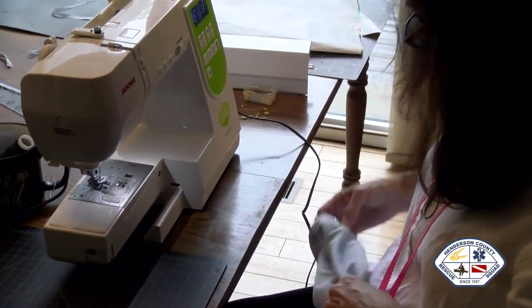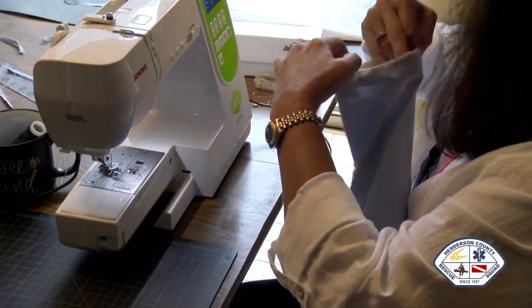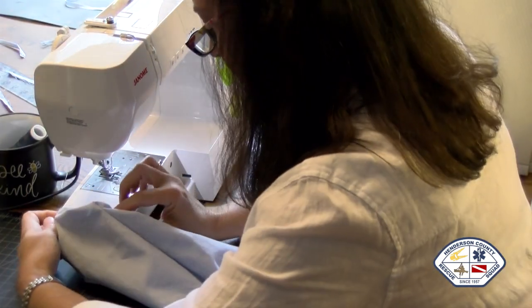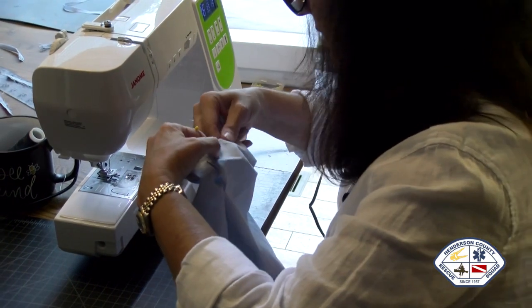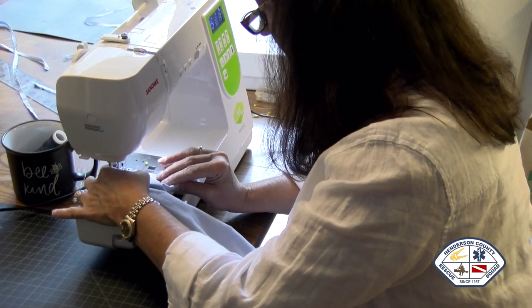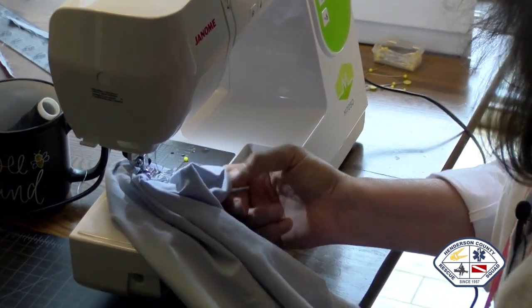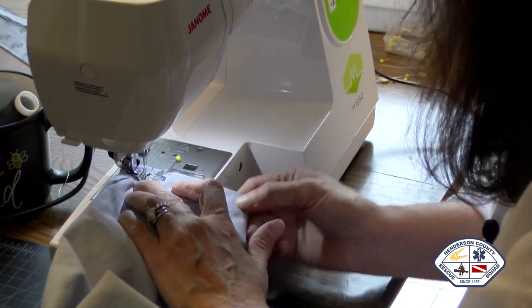Take that off. Gosh, that's the first time I've even taken that piece off. Will this fit? No, it doesn't fit, darn it. Okay, it's all right. We got this. We're gonna use our handy dandy guide. Use your lines on the side of the machine. And we're gonna zigzag.